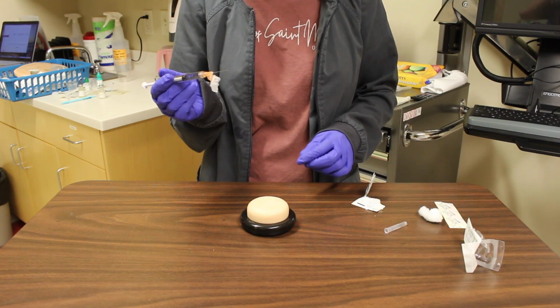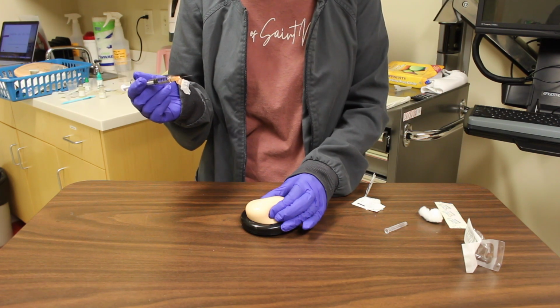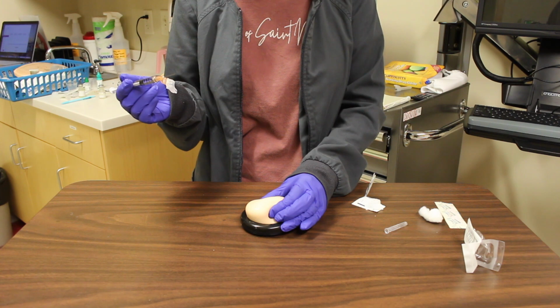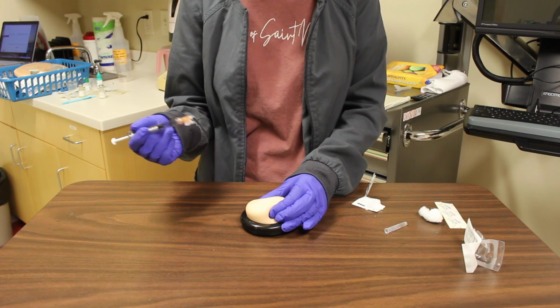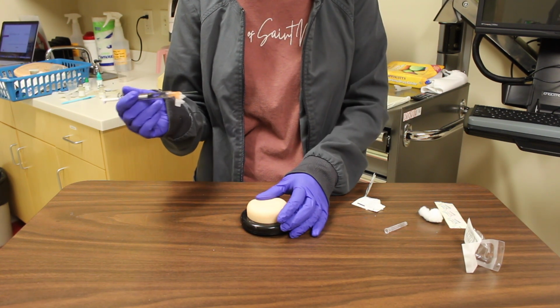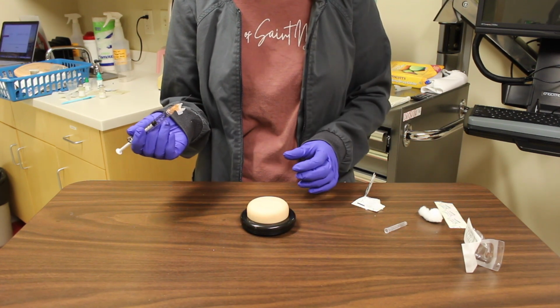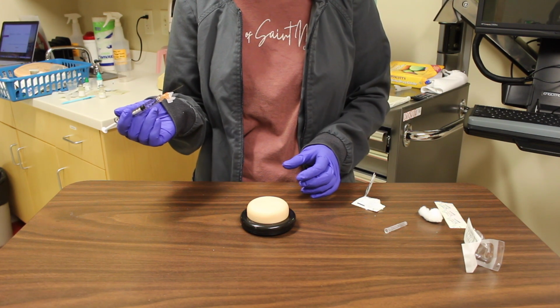With a non-dominant hand, pinch or pull the skin taut at the injection site. This will depend on the patient's size. If the patient's average size, or when you pinch their skin it is less than 1 inch, inject at a 45-degree angle. If the patient is obese, or when you pinch their skin it is greater than 2 inches, use a 90-degree angle. At this point, you could also use a longer needle as well and spread the skin taut instead of pinching.